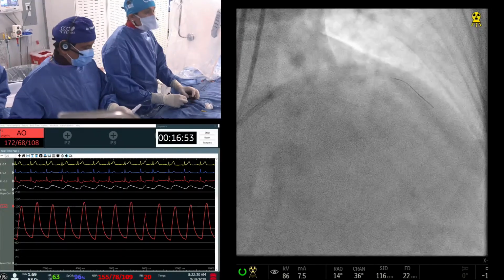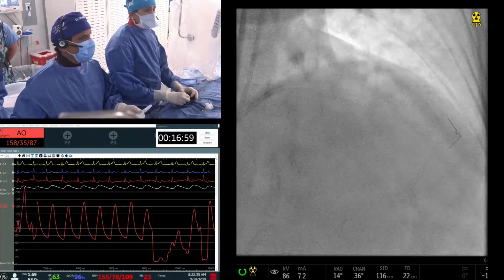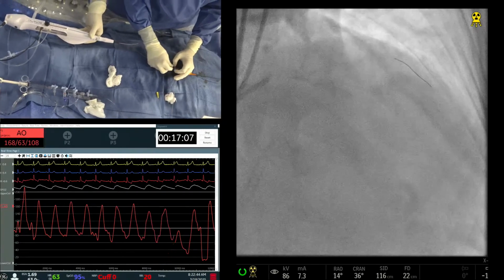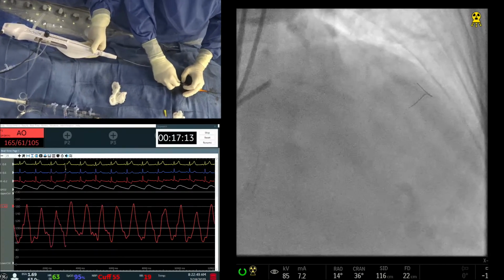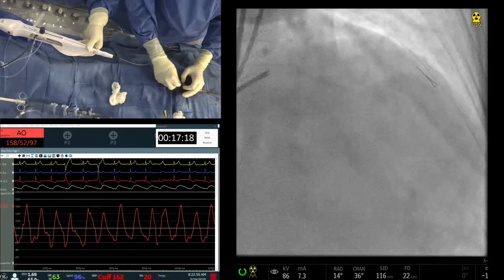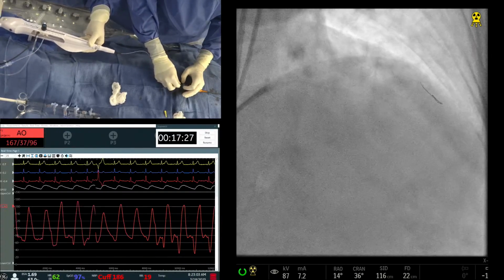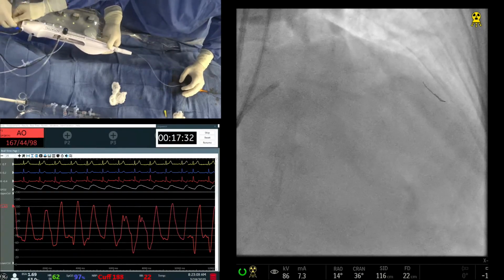Hold it. Good. No, wire. Pull back. That's good. No, pull back. As you see, once you go to the side branch, push and pull is a little more materialistic. Sometimes it will make a curve, I mean loop, but I think we are going okay. No, a loop is worse than a single.